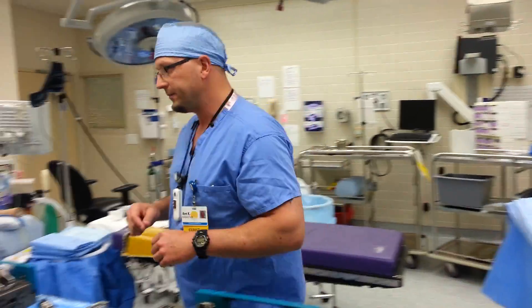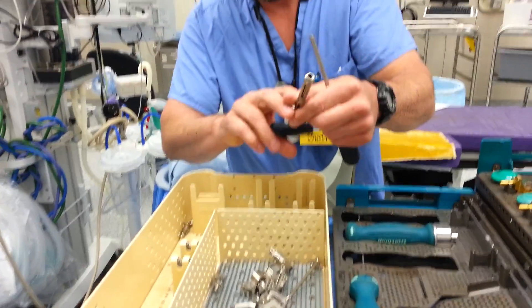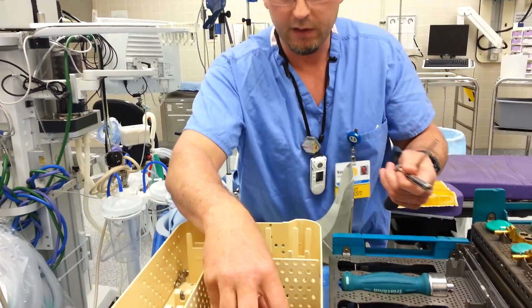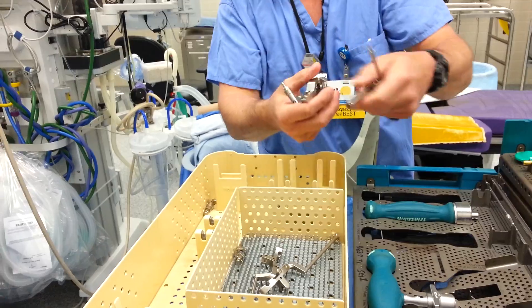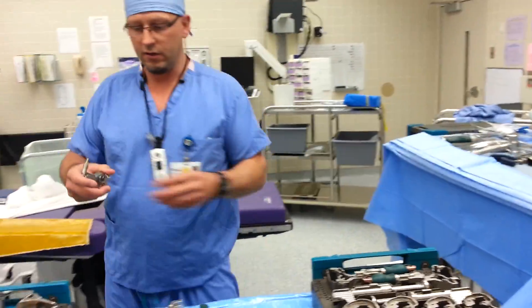Next we're going to get some more parts out. You need a screwdriver, you need this pin to put your tibial pin in with, and you need these two brackets. Set these down and we'll come right back to this tray and use those in a little bit.